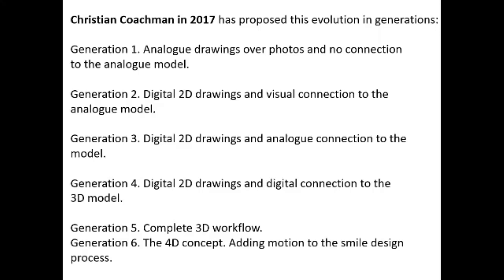In generation 6, it's a 4D concept in which a pre-op video of the patient is taken, and the digital smile design is incorporated into the video. Whatever treatment is done, the final outcome will be visualized in the same pre-op video and projected to the patient. Whereas the other 5 generations dealt with photos, the 6th generation deals with the video of the patient. So it gives more patient acceptance when compared to the other 5 generations.